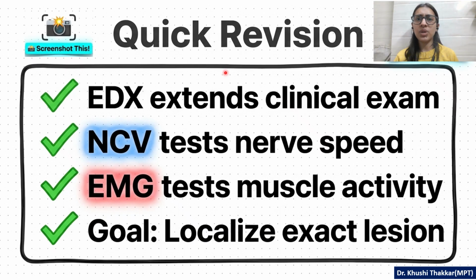Now, in the acute case, you will not understand on clinical examination whether there is an axonal injury, whether there is demyelination, or whether there is only a conduction block due to compression. All this will depend on the amount and the duration of compression. But there is no objective measure of it until you do an EMG NCV, which will help us understand the exact pathology.